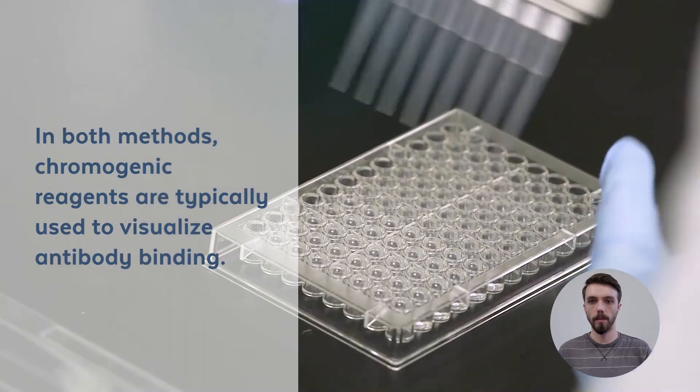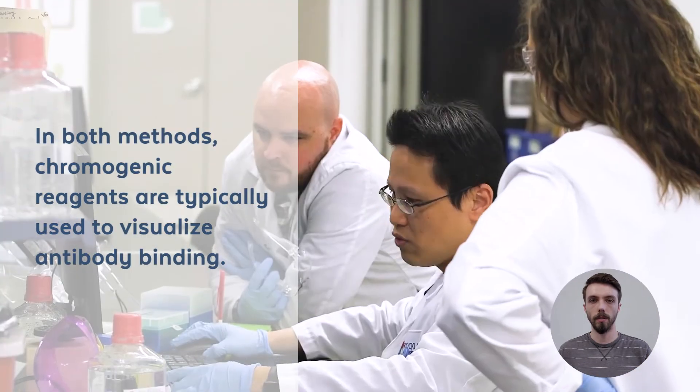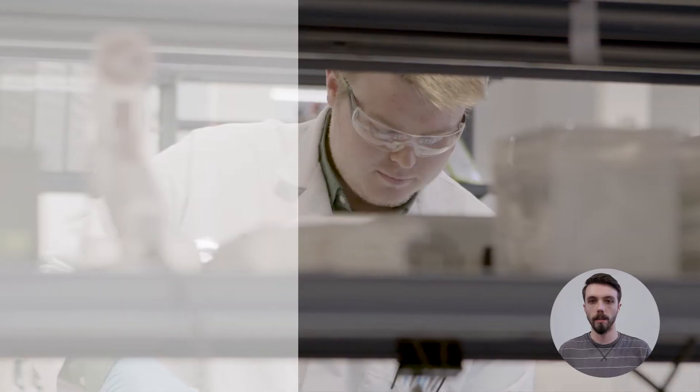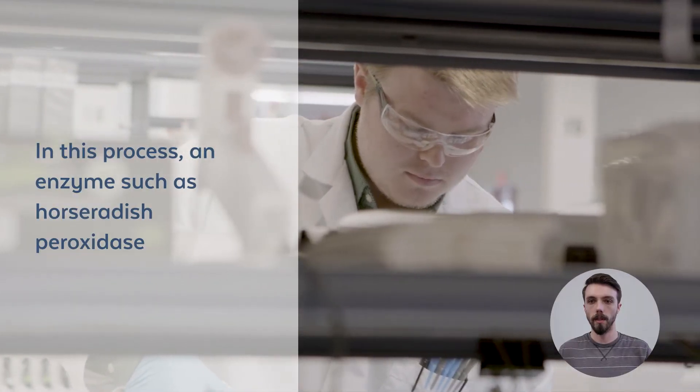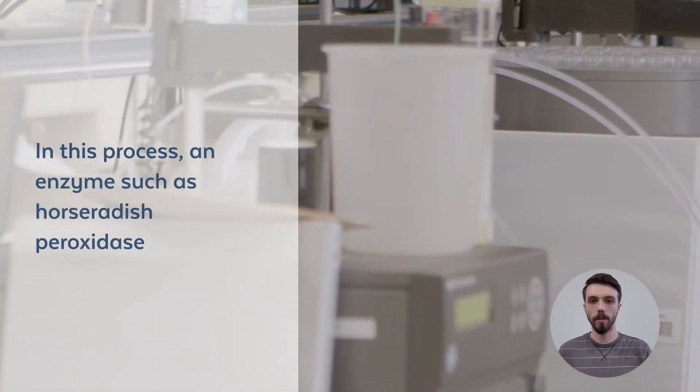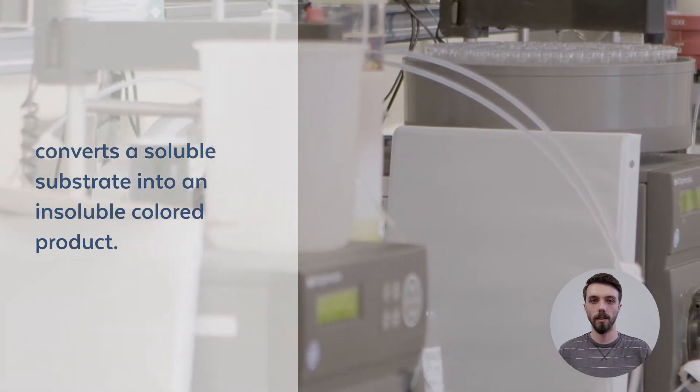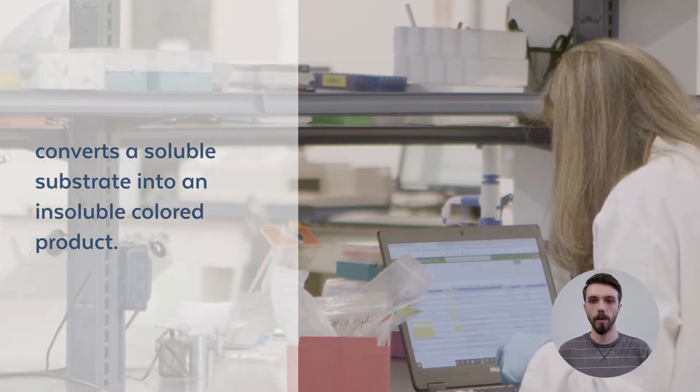In both methods, chromogenic reagents are typically used to visualize antibody binding. In this process, an enzyme, such as horseradish peroxidase, converts a soluble substrate into an insoluble colored product.